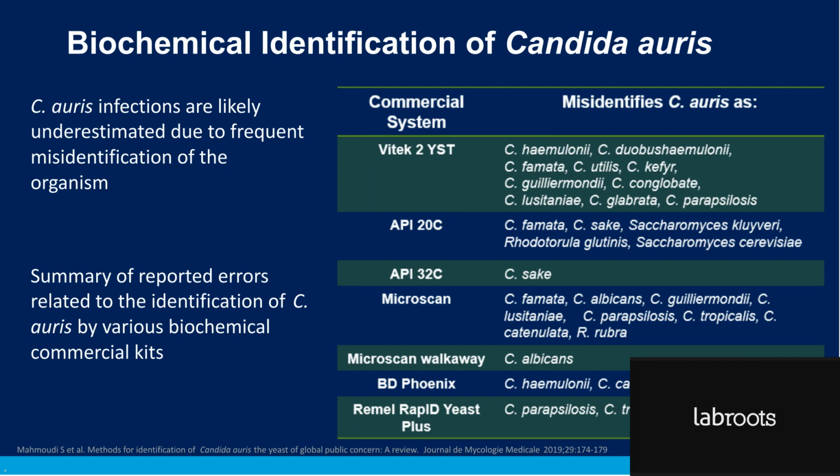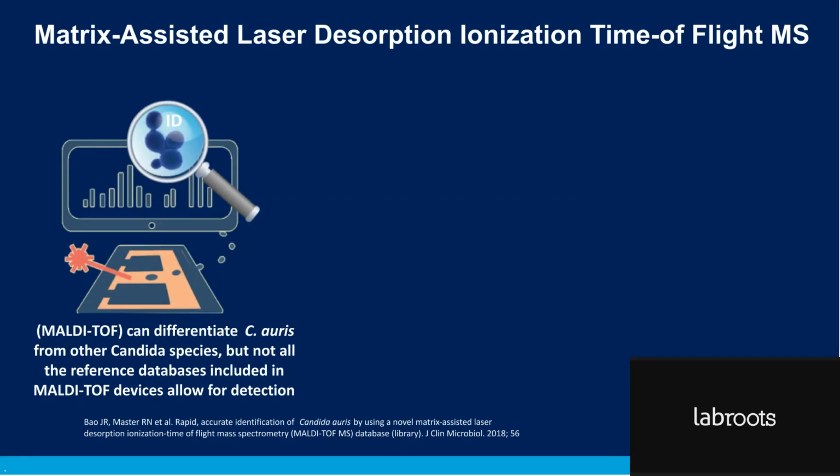Fortunately, matrix-assisted laser desorption ionization time of flight, more commonly referred to as MALDI-TOF, mass spectrometer, has really come to help.